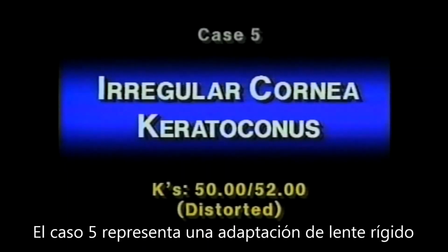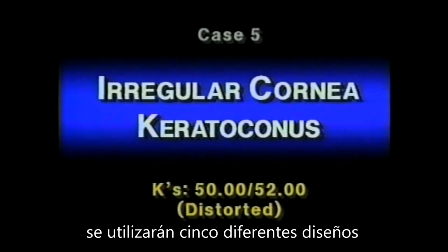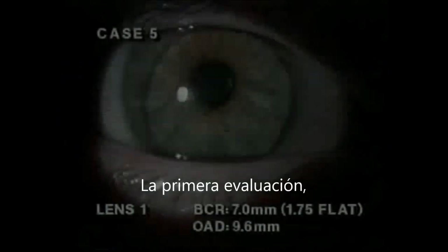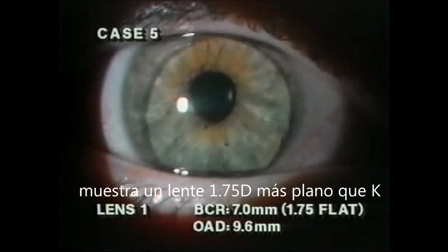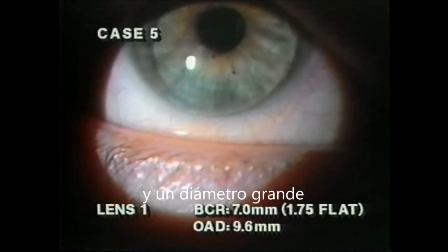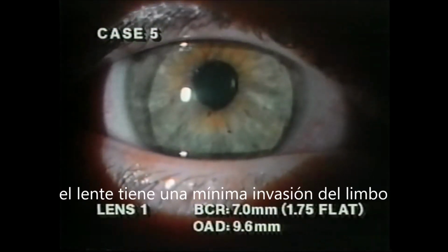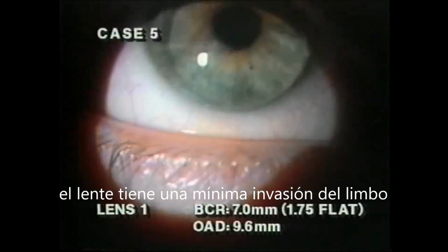Our 5th case pertains to rigid lens fitting on an irregular cornea. 5 different lens designs on a keratoconic patient will be evaluated. We begin our evaluation with a diagnostic lens having both a large optical zone and overall diameter. This lens decenters inferiorly after the blink. Lens lag is at a minimum, which could result in both trapped debris and lens adherence.